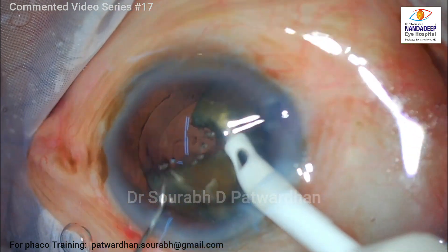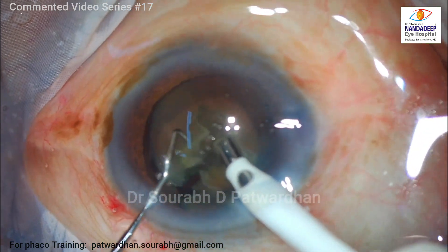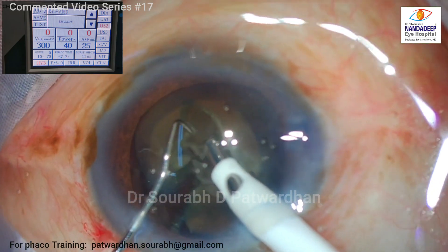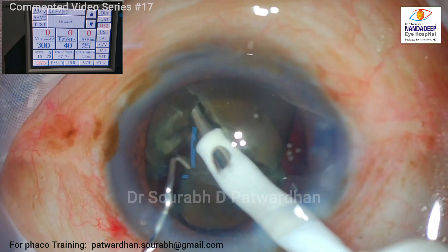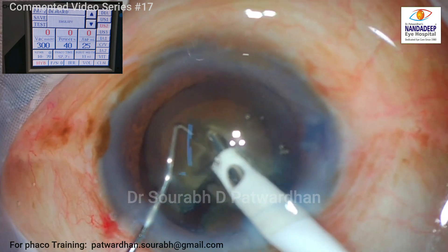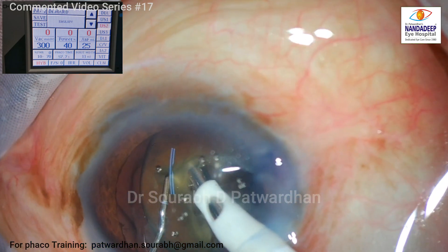With Hyperburst mode, power increased to 40%, and vacuum to 300, I could get a good hold. The hybrid chopper is essentially a modified Sinskey — a 1.25 mm Sinskey with a blunt tip, so I am not worried about the posterior capsule. The final parameters are 40% power, 300 vacuum, 11 ms burst width, and I am using 110 cm bottle height for chamber stability. While burying the tip, I have to make sure I don't push the nucleus too far and don't stress the zonules and posterior capsule.